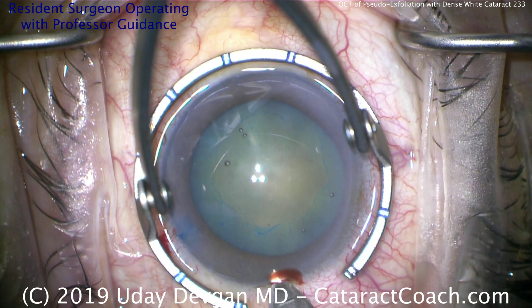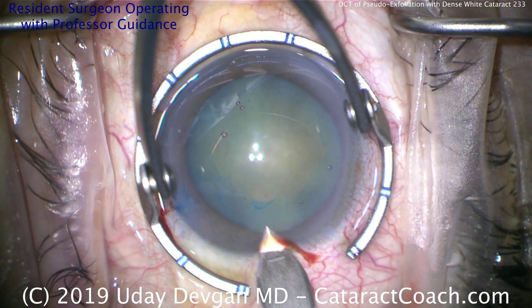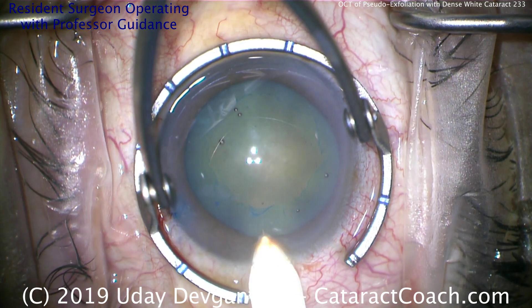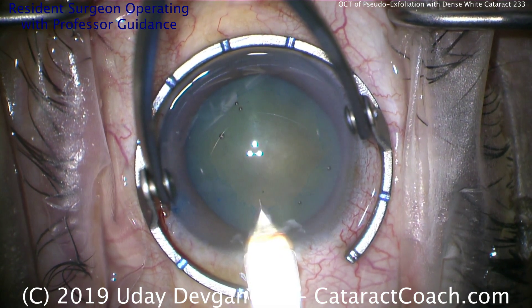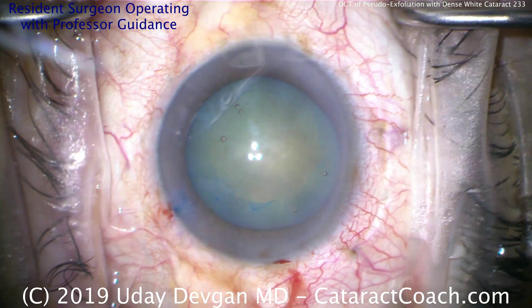Let's go ahead and make the main incision. Here's the keratome — he's going to make a temporal incision. Looks excellent, good overall architecture and length. Tunnel length is good. Entering the AC now. There we go. And out we go. That was done beautifully.